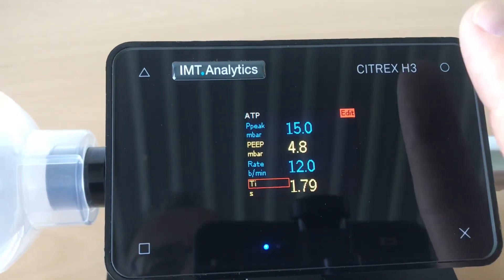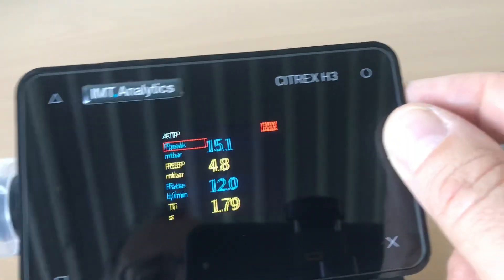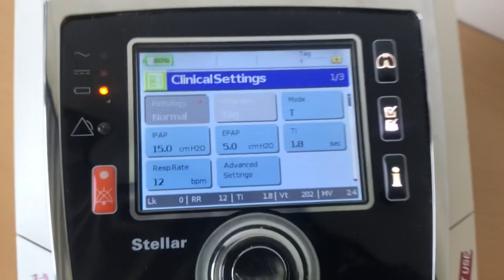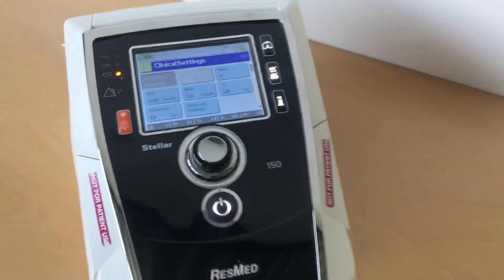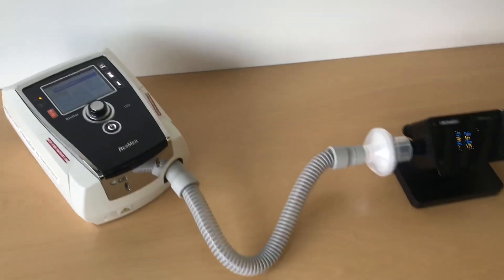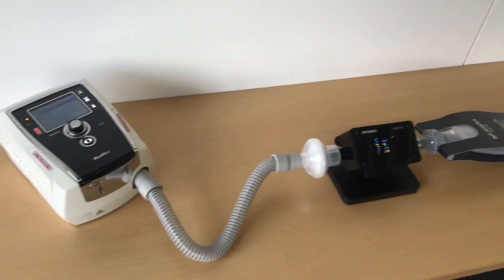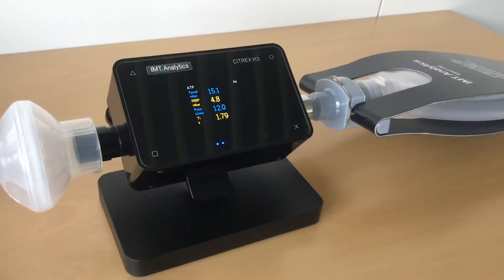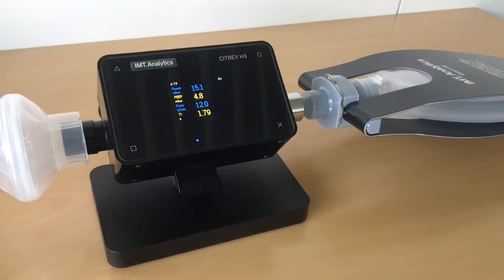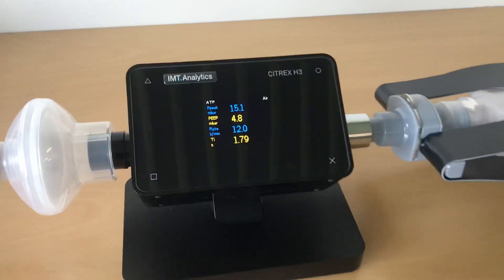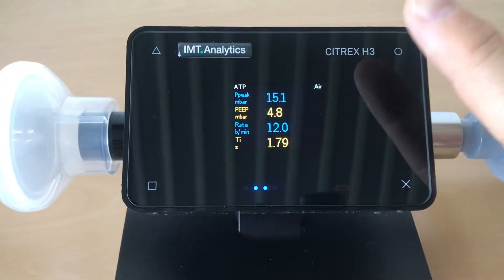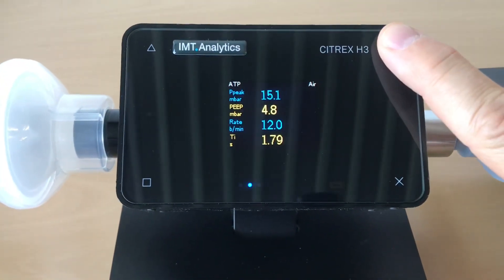Now if you have set up the whole screen, you can start comparing the settings on the ventilator with the measurements on the Citrex device. It's very easy, and if these measurements are within the tolerance specified in the user manual of the ventilator, then the ventilator is performing fine.